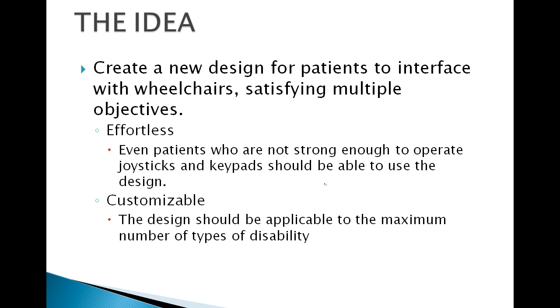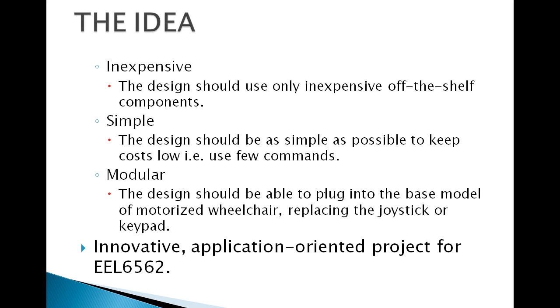It should also be highly customizable, so that the design is applicable to the maximum number of patients possible. It should be inexpensive, so that it is accessible to patients of all economic standing. It should also be simple, so that cost of implementation is kept as low as possible.